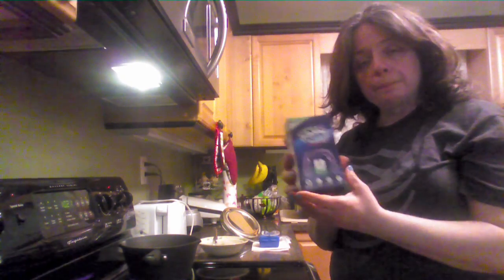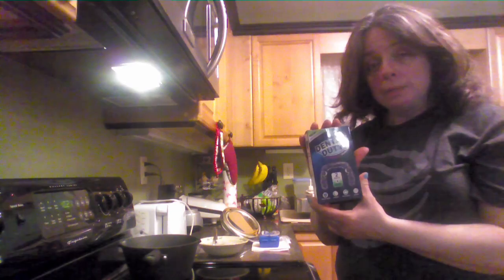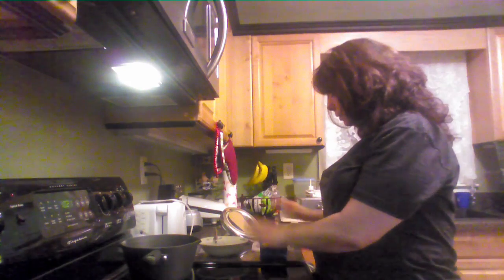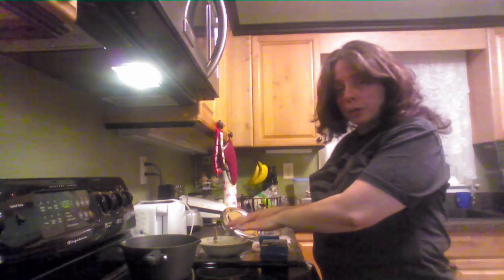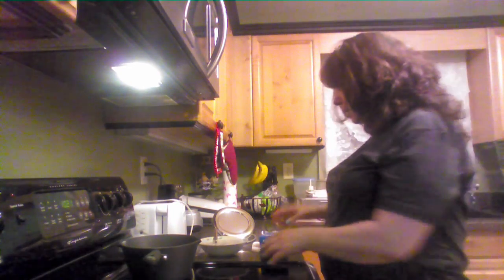If you make a mistake on molding it, they'll send you a replacement for free. What you'll need to get it set up is a pot of boiling water, a bowl of ice water, and a mirror so you can see to fit it, and a timer, which I have one on the stove here.